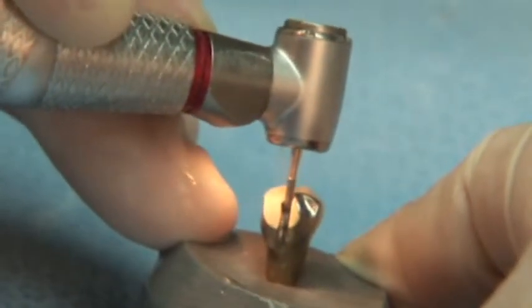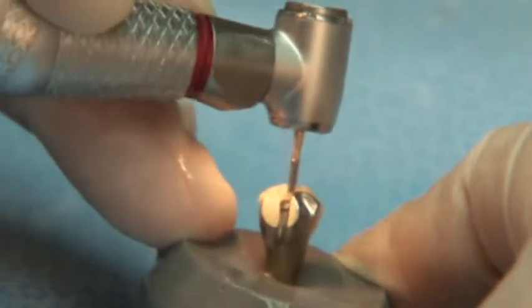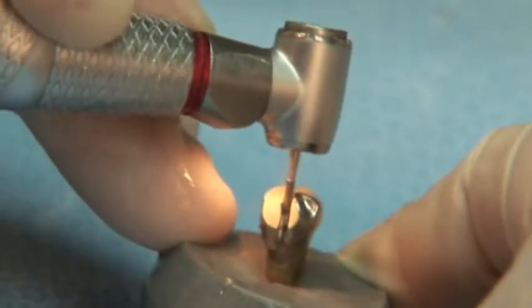Clinicians love the fact that with the Great Whites, they no longer go through two or three burrs to remove an old crown.